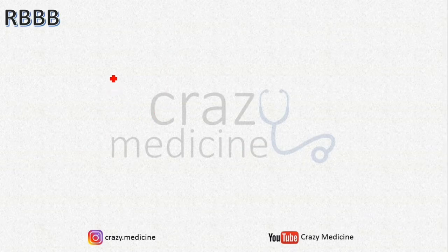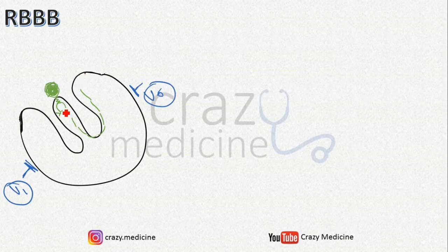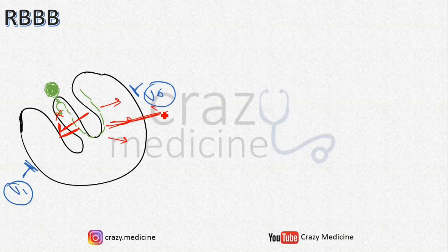First is right bundle branch block. As you can see in the image, the right bundle branch is blocked, so current cannot depolarize the right ventricle as it does normally. Here there is depolarization of the septum first, which is from left to right direction. Then there is depolarization of the left ventricle by the normal left bundle branch, and its vector is towards the left. And at last there is delayed depolarization of the right ventricle because current will pass through the right ventricle myocardium proper, not from the right bundle branch, and this produces a rightward vector.